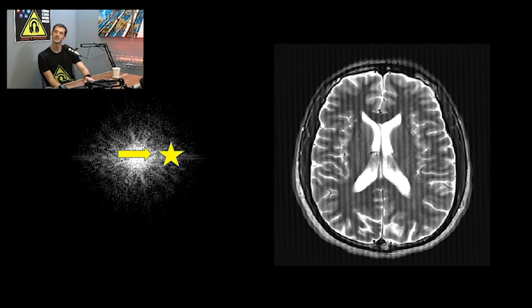Well, let's just see. So the lines are in the same direction, right. But they're much tighter. Tighter. Okay. And that's because as you went from the center being the low spatial frequencies, as you go to this middle distance, it's like a medium frequency. And that's often when I see it, it looks more like this. And that's right.